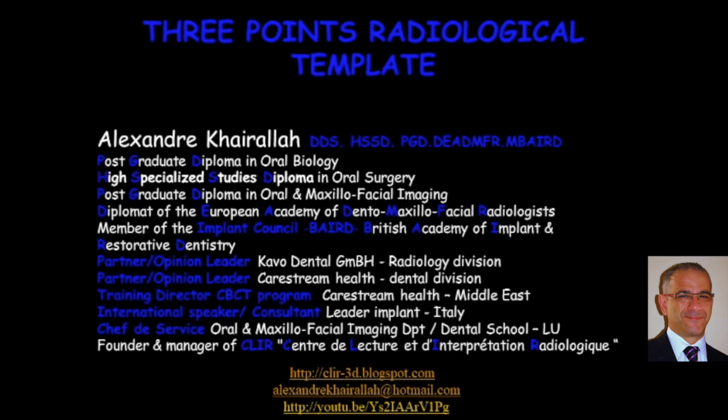Our subject for today is about the 3-point radiological template.